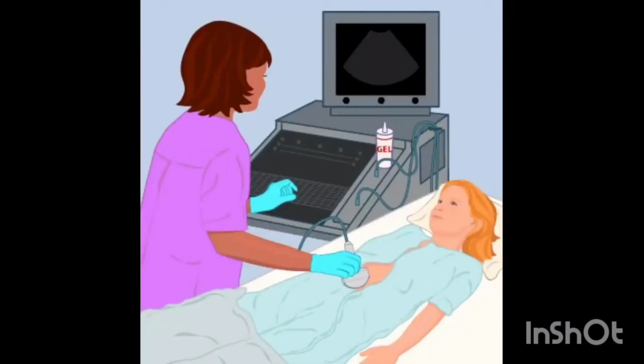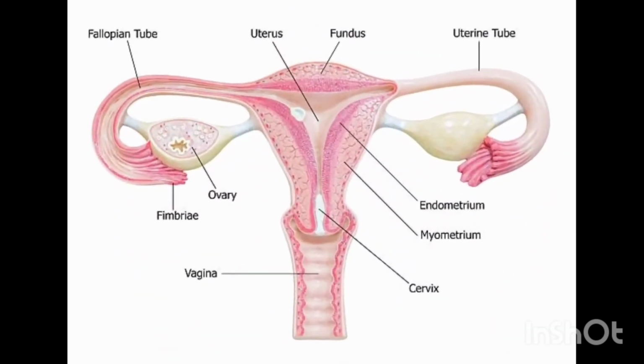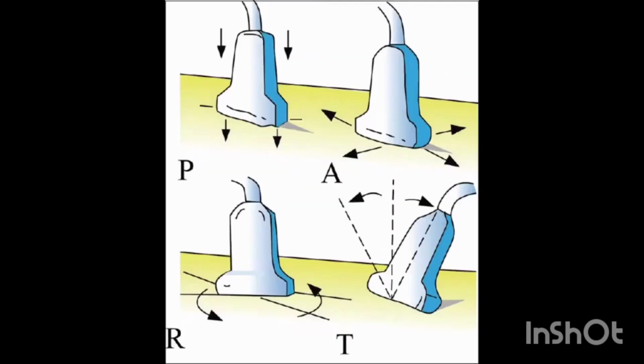Gynecological sonography is an important diagnostic modality commonly used to evaluate emergent conditions and many common gynecological disorders. Knowledge of the anatomy and physiology of the female pelvis is an important prerequisite in obtaining and interpreting gynecological sonographic images.